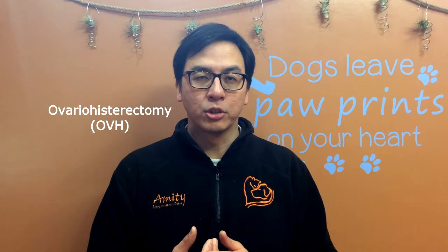Before that, what we've always been trained to do is the traditional open spay method, whereby a long incision is made along the abdomen and from which we will exteriorize the ovaries and remove them together with the uterus. It's what we call ovariohysterectomy, or OVH for short.